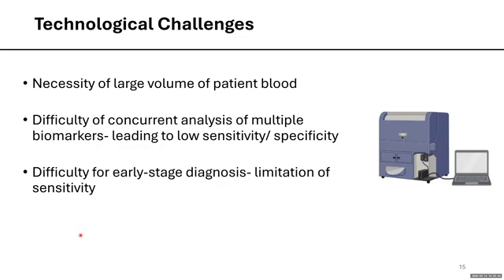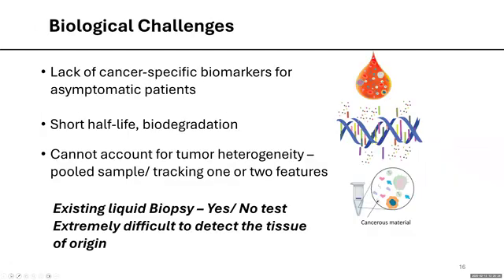Detecting an array of biomarkers simultaneously to give a conclusive result is not possible with these liquid biopsies. And trace level biomarkers at an early stage are almost invisible for these liquid biopsies. The biological challenges are that biomarkers are many times non-specific to cancer.